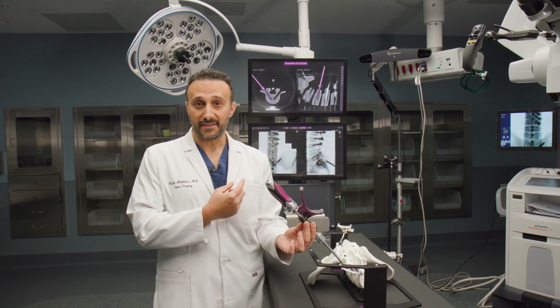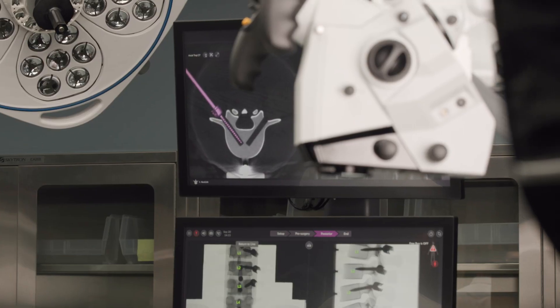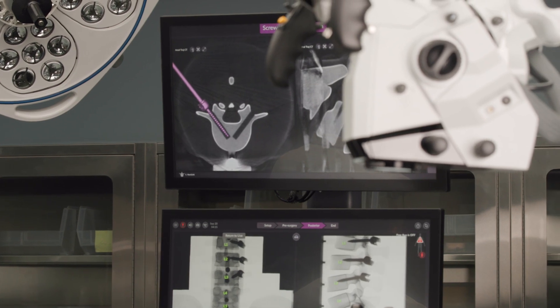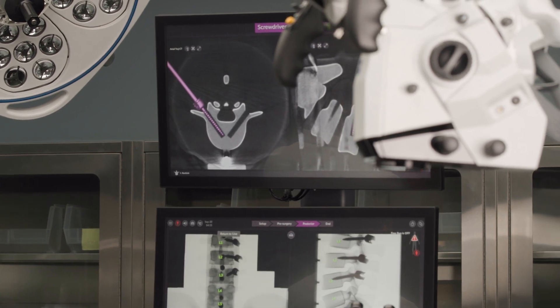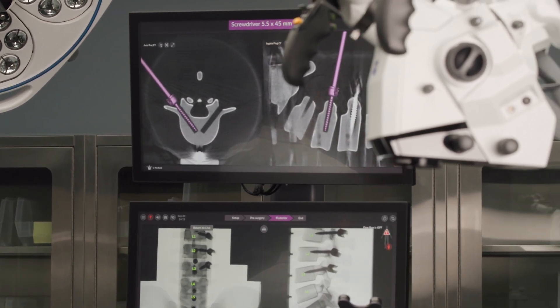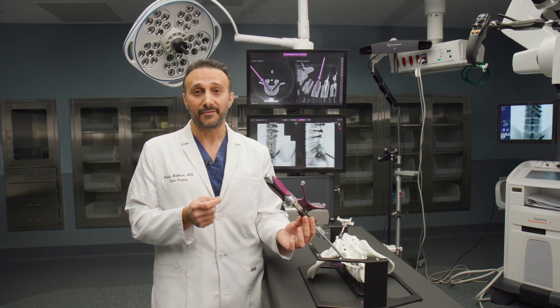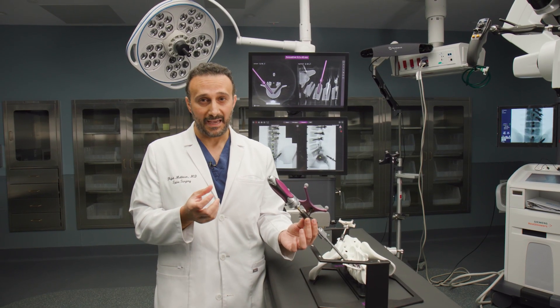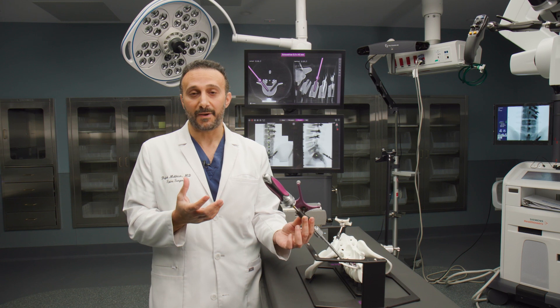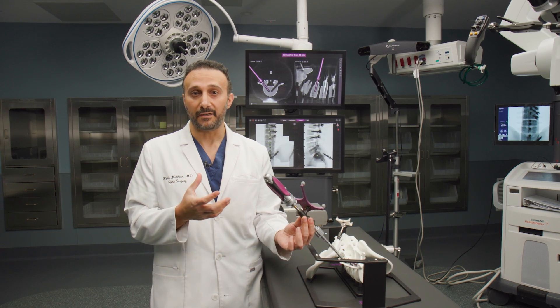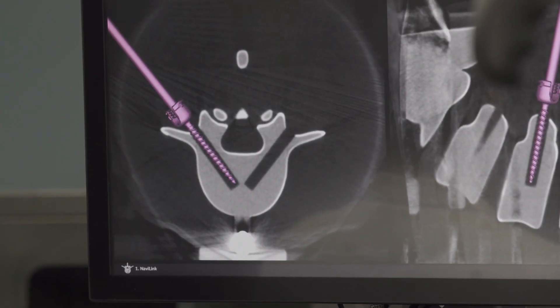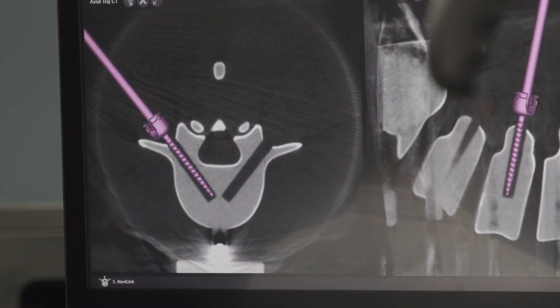The advantage of having this is we don't have to take extra x-ray images, which limits the radiation to everybody in the operating room, and it tells me exactly in three dimensions where that screw is going. This is very helpful in patients that have abnormal anatomy — some patients, because of their spinal pathology, have their spine twisted in an odd way, and placing those screws can be extra challenging when you don't have this type of three-dimensional navigation.